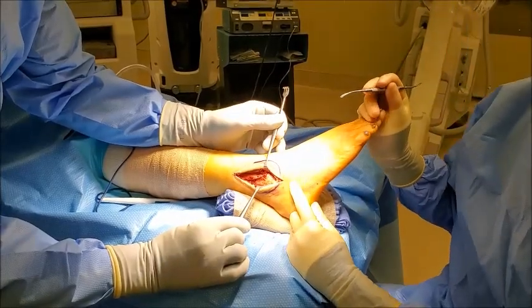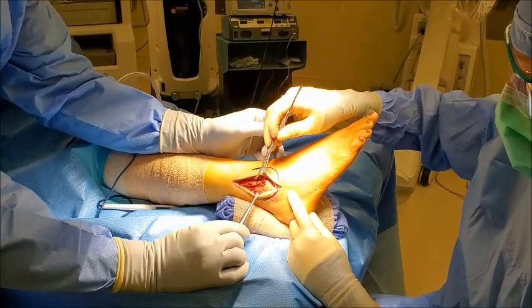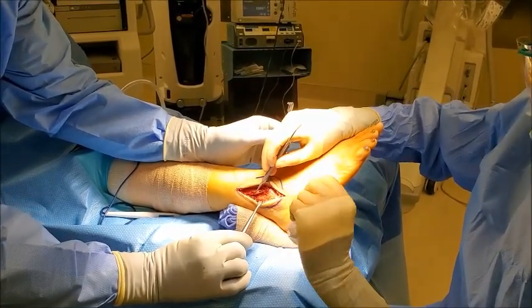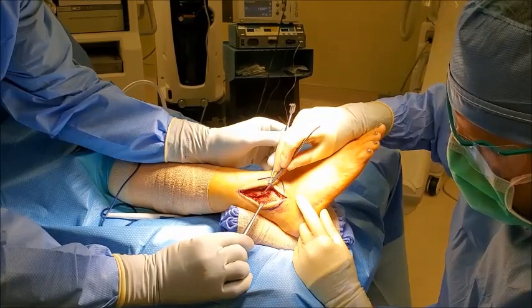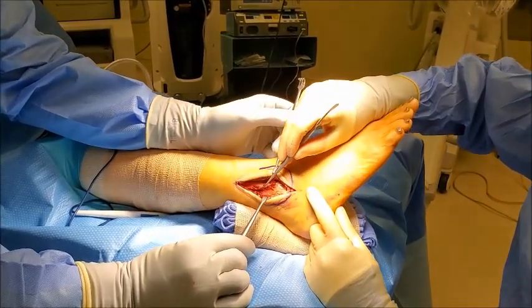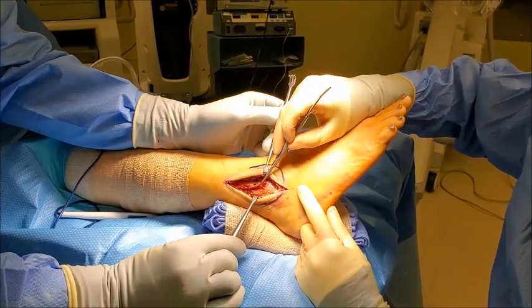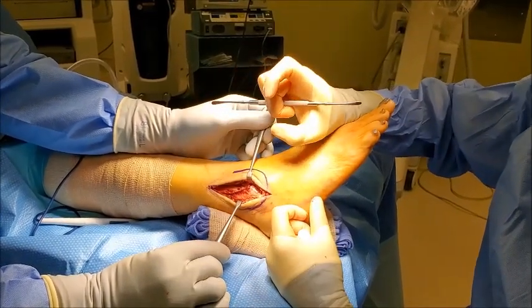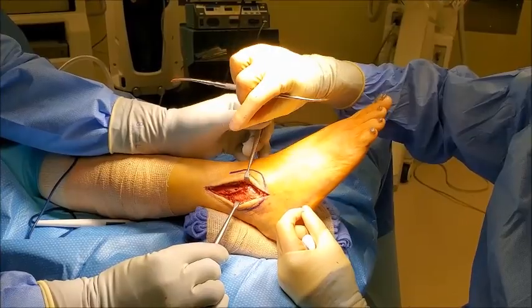As you can see now, what we've done is exposed the lateral malleolus. This is where the typical largest fracture is. It's called a spiral oblique fracture — a twisting that occurs in that bone. You can see the fracture line here. The next step will be to remove the hematoma, or the clot that has formed inside that site, and then we'll compress that with a small clamp and put a plate with screws on the side.